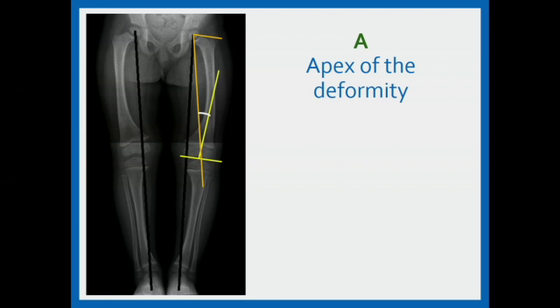So you first point out the center of the femoral head, the tip of the greater trochanter, join the two lines. Then you drop a line. You know the normal value of the lateral proximal femoral angle. So you take that angle and you drop a line down. If you don't know the normal population, and if the other side is normal, then you can use the other side value as well for the same.